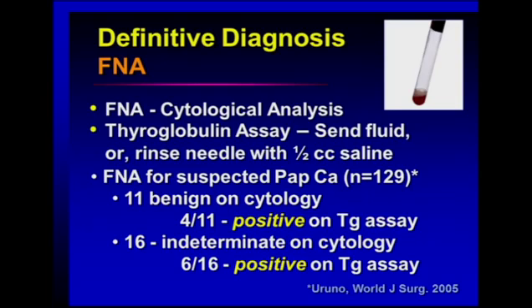So it is a more accurate method of determining the nature of a nodule in the lateral neck, and in our practice it's become relatively inexpensive with a turnaround time of just a few hours, so it really may, if not replace, certainly supplement standard cytologic analysis, FNA, of these lateral masses in the neck.